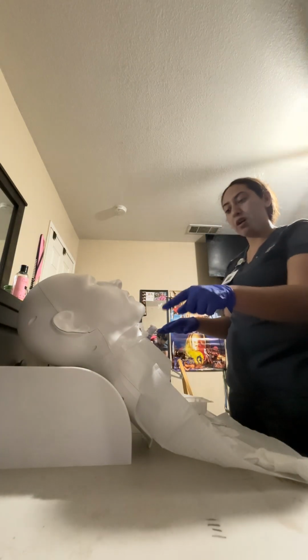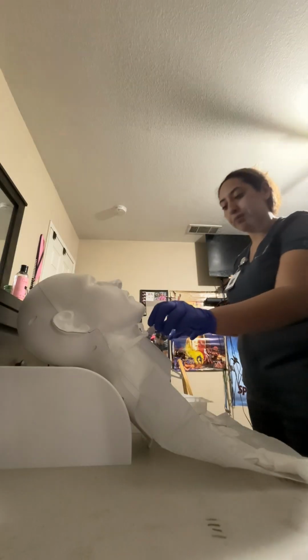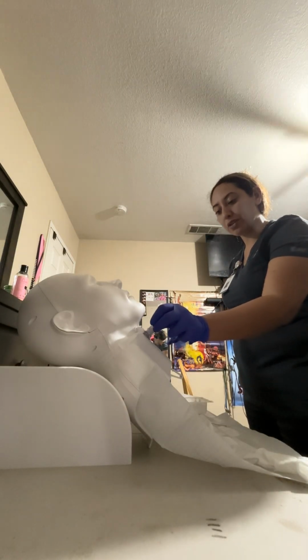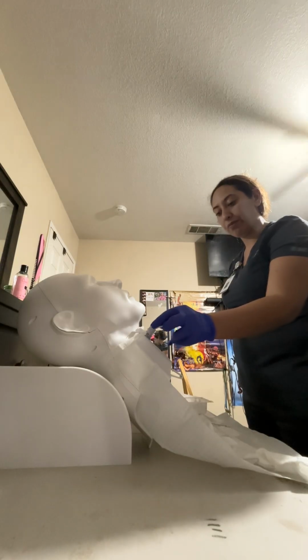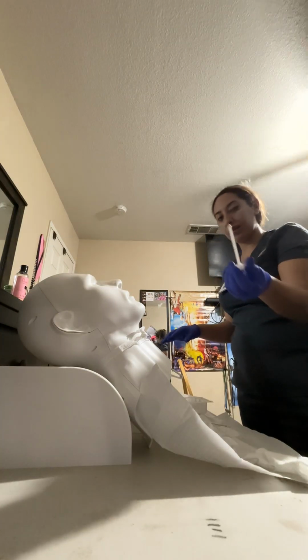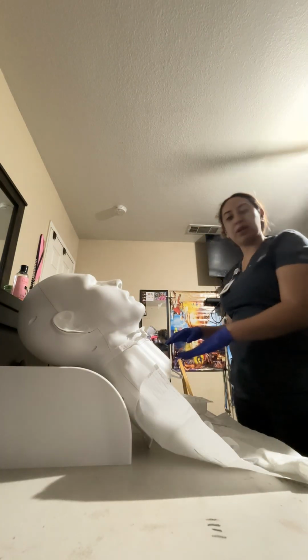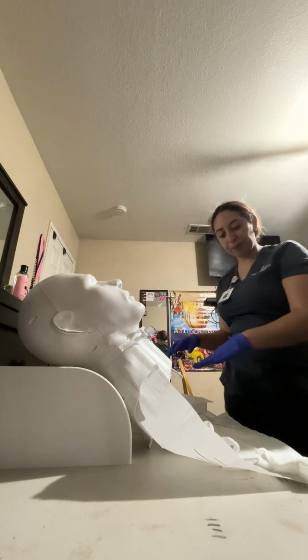Okay, Alfredo, I'm going to remove your inner cannula. I'm going to place it here in the bin and soak it. So I'm going to twist and unlock my patient's inner cannula. So after removing it, I'm going to place it in the soaking bin. I'm going to allow that to soak over some time.